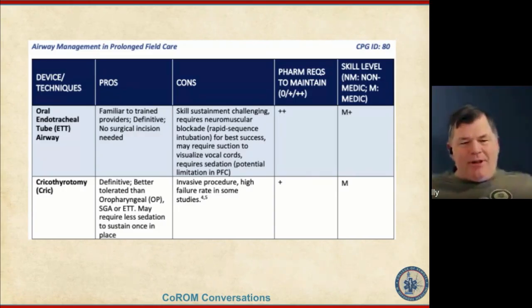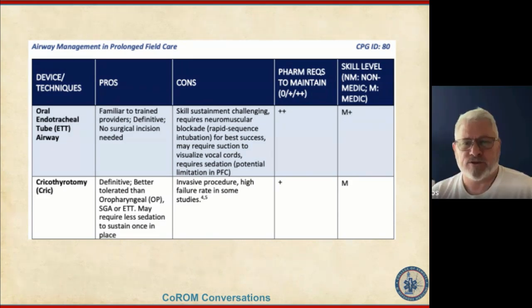The amount of equipment needed to keep an intubated patient down, you're burning through a lot of your stuff. And there's a way to manage that better than others, but once again, it's a cost you need to consider when deciding: can I manage this patient and sufficiently oxygenate them with a BVM, or do I need to take an advanced airway? You're making those decisions on the fly, in the situation, at the time.